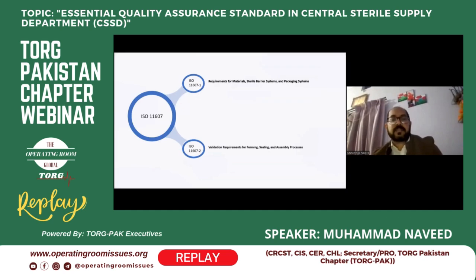ISO 11607 has two main categories. The first one tells us the requirements for material, sterile barrier system, and the packaging system.